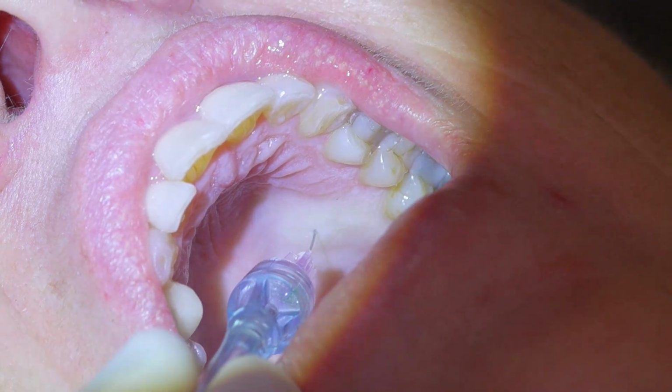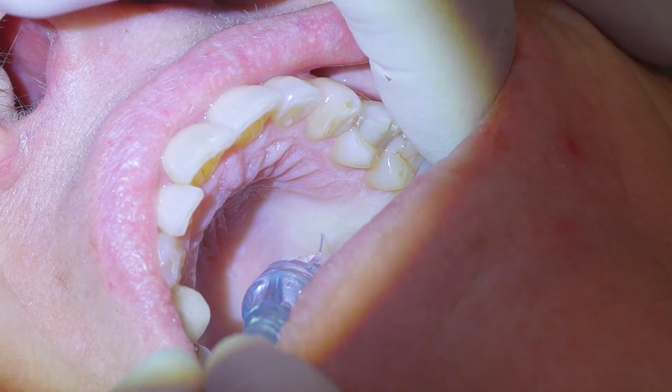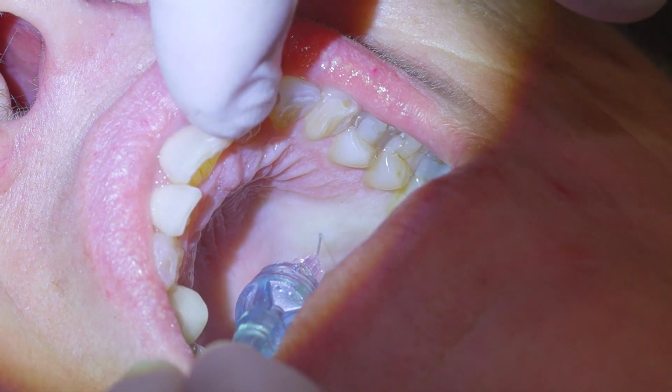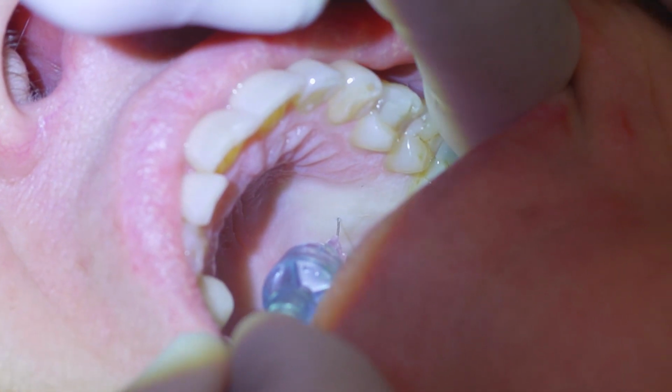We're chasing the anesthetic. So the tissue in front of the needle is already numb, and you can see all that blanched tissue on the palate. So the patient is feeling nothing, and it makes this a better experience.